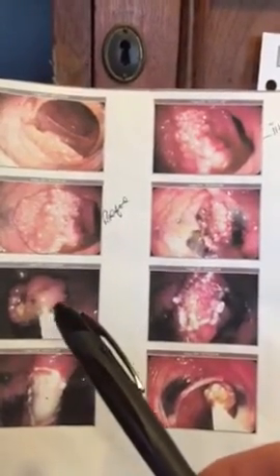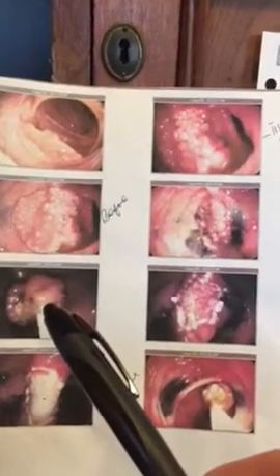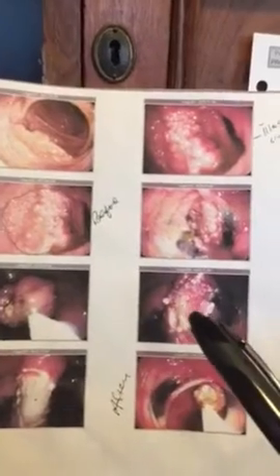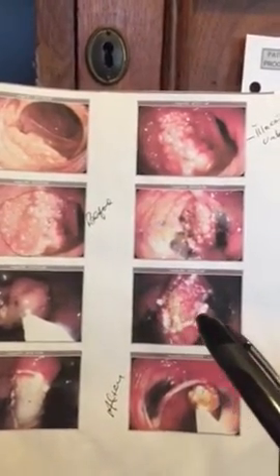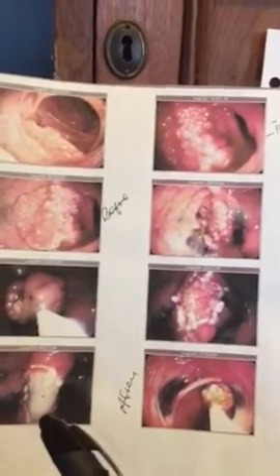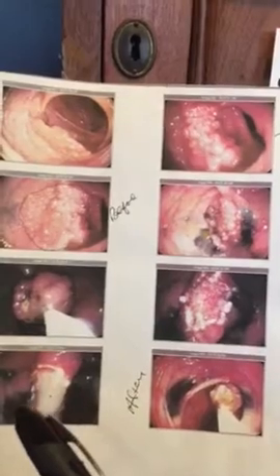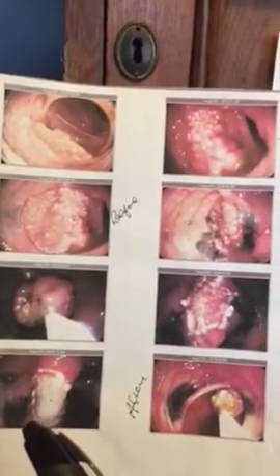This is a particular instrument that we utilize to grab the polyp and pull it out of the colon. This is what the tissue looks like afterwards. These are cauterized edges of the polyp that's been removed off the ileocecal valve and the cecum. And this again is the tissue afterwards, and these are the tattoos that help localize the area so we know where to look the next time we go.